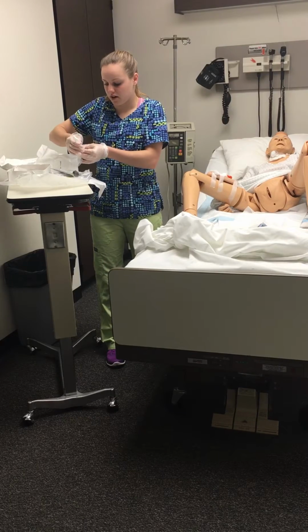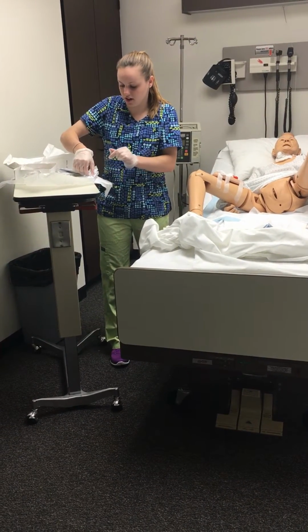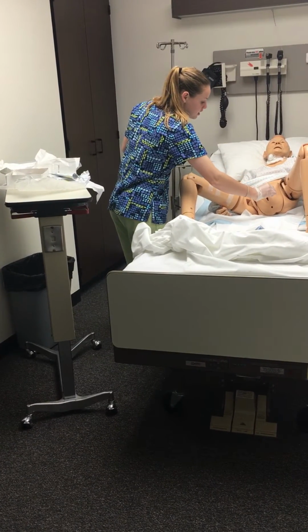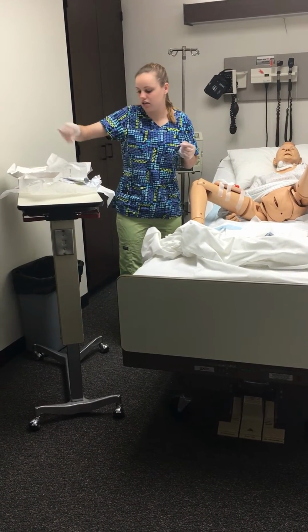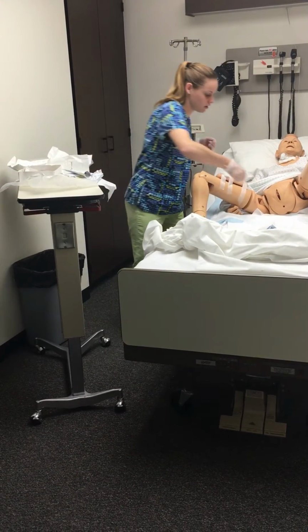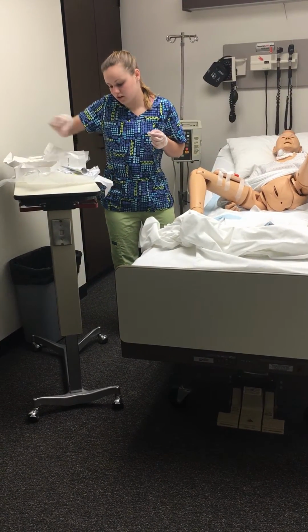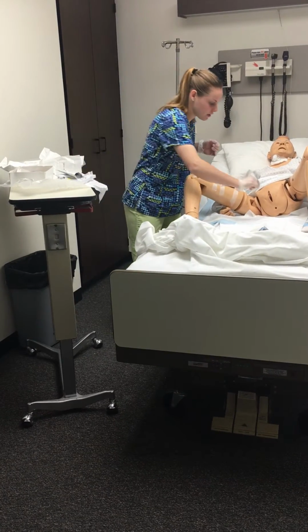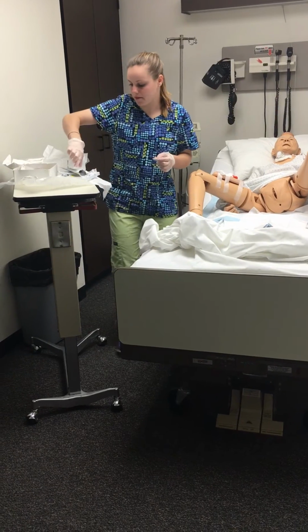And I can perform care to make sure her peri area is sterile, so I just take one swab for each side. Dispose of that. Dispose of that. And then the last one will go right down the middle. And we'll dispose of that. Okay.